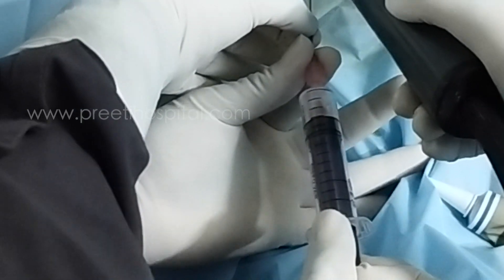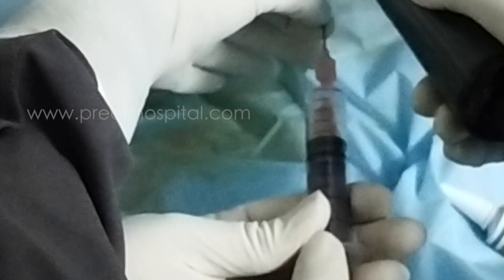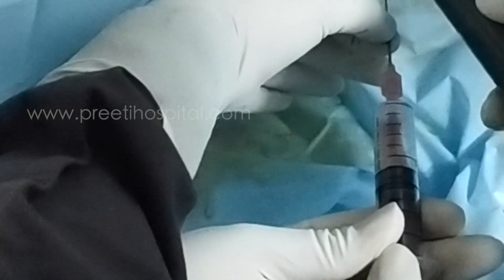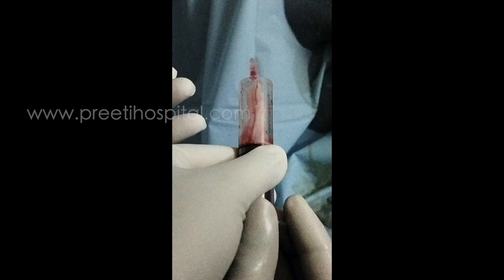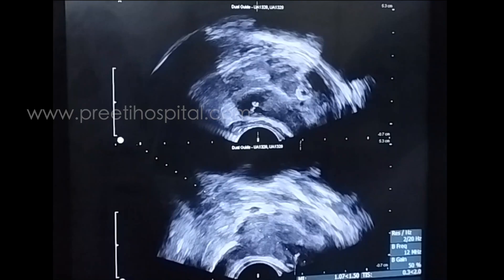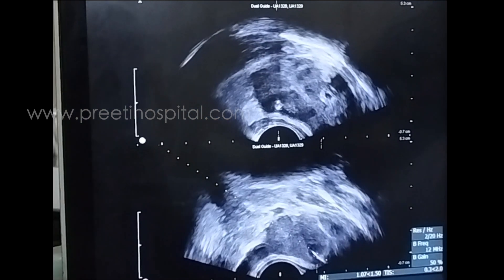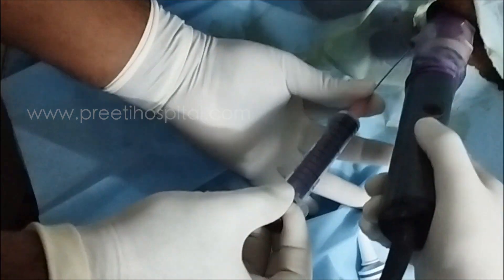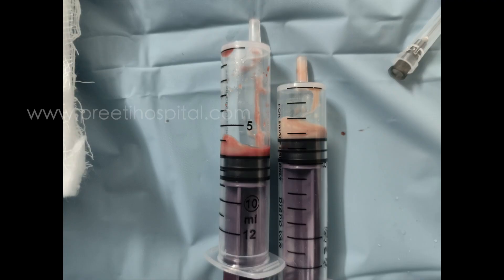Our immediate aim was to do minimally invasive drainage — that is, transrectal drainage through ultrasound-guided needle aspiration. Wherever hypoechoic clear fluid was available, we aspirated, and every aspiration yielded 2 to 3 ml of pus, which is more than enough to reduce the infection and systemic inflammatory reaction.